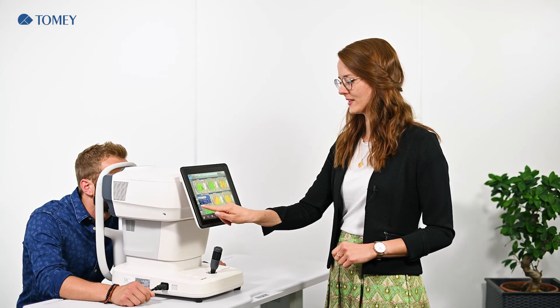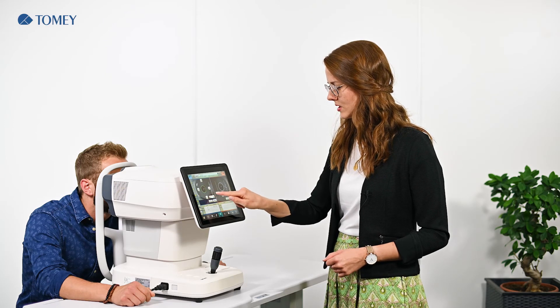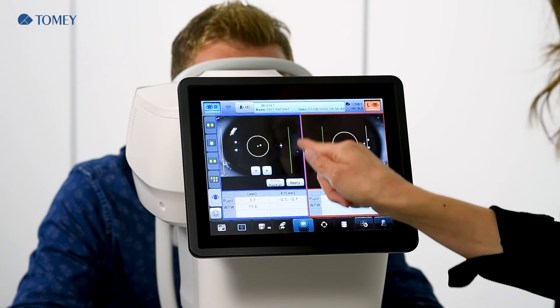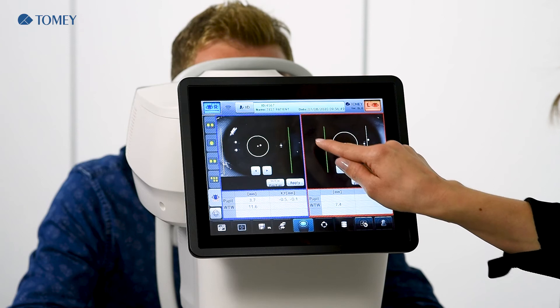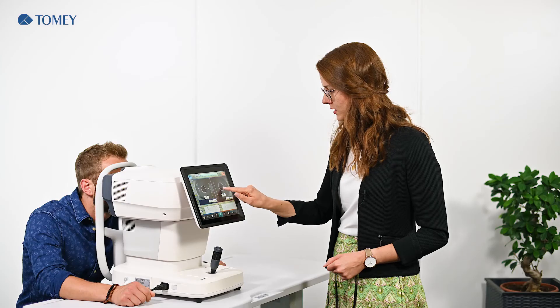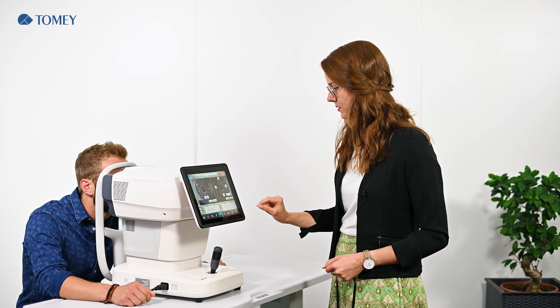You also have the possibility to measure the pupil size and the diameter of the cornea. Just tap into the display and adjust the circles and bars to the size you need. Here we adjust the pupil size. Afterwards, tap on the bar and put it onto the edge of the cornea. On the left side it is already correct. We go to the other eye and again select the bar and put it to the edge of the cornea here as well, and the same with the circle for the pupil size.